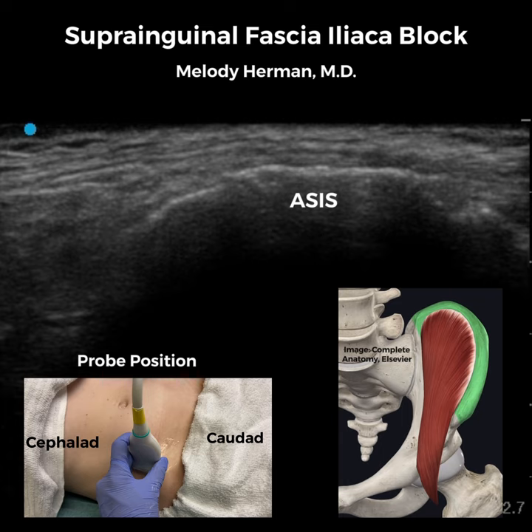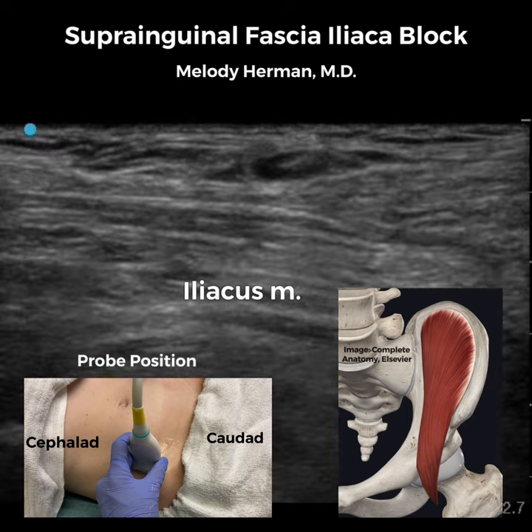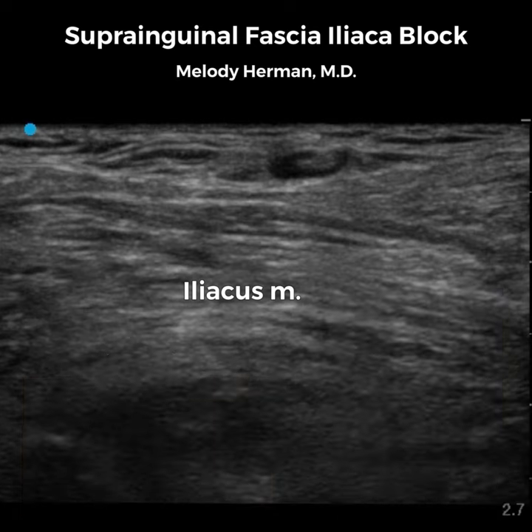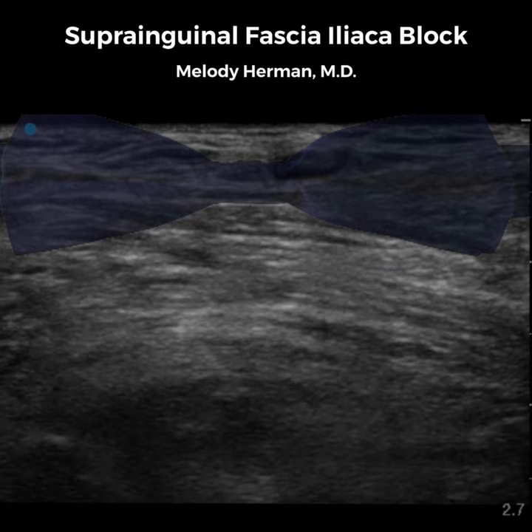The anterior superior iliac spine is easily palpable in most patients and we'll start by placing a linear probe over the ASIS. The iliacus muscle lies adjacent to the ASIS and we can easily identify it by sliding medial just off of the bone. Overlying the iliacus muscle, we have the internal oblique muscle cephalad and sartorius muscle caudad. This view is described as looking like a bow tie.